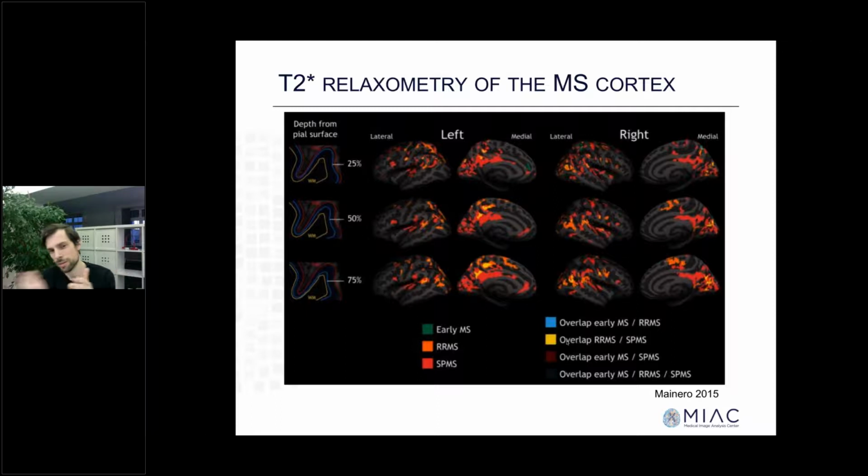But on the other hand, we have trouble displaying them in the MRI scan. Even when you look at 7 Tesla MRI with a very high resolution and the strong magnetic susceptibility effects, the very brilliant contrast, you will only find a few of them, and you will miss the majority. And at 3 Tesla, you see even less, and at 1.5 Tesla, it's a chance to see any of them.